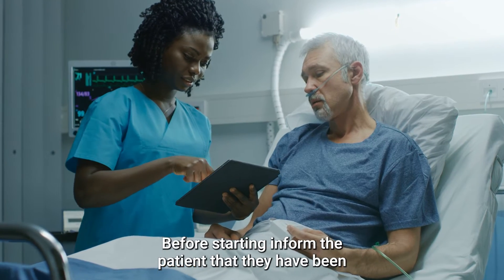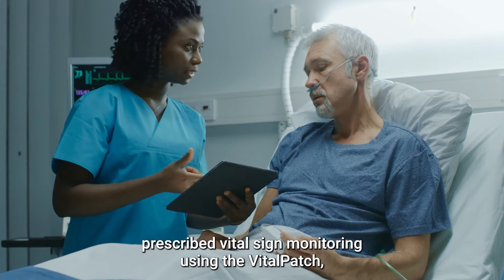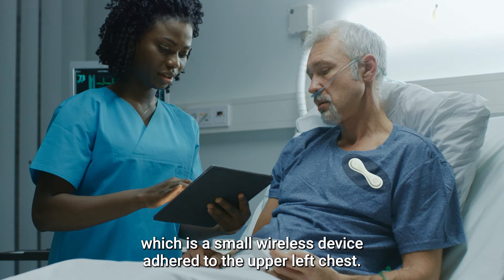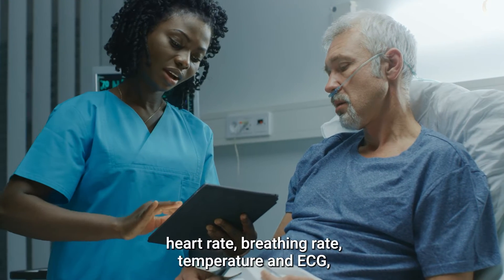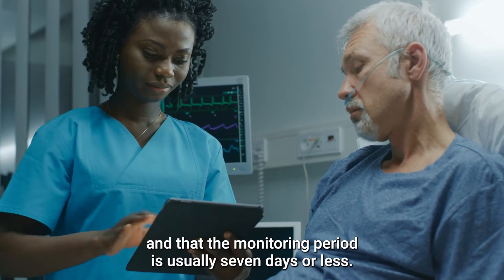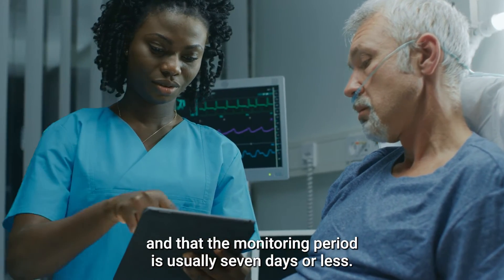Before starting, inform the patient that they have been prescribed vital sign monitoring using the Vitalpatch, which is a small wireless device adhered to the upper left chest. Inform the patient that monitoring includes heart rate, breathing rate, temperature, and ECG, and that the monitoring period is usually seven days or less.